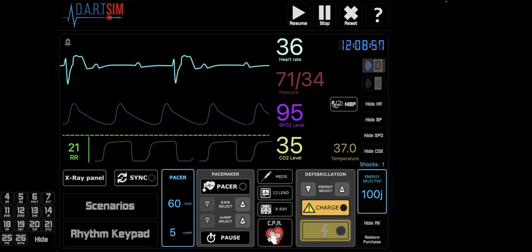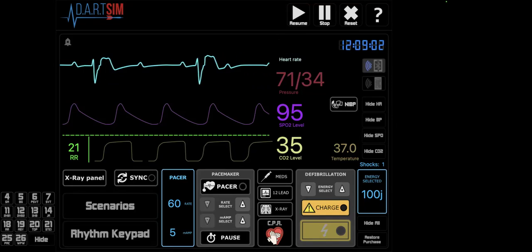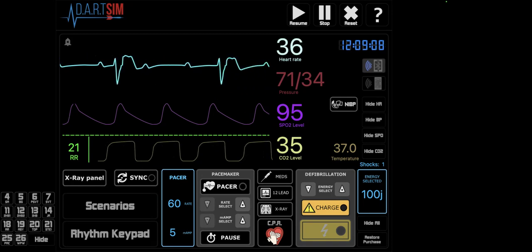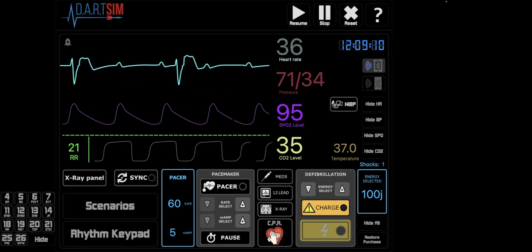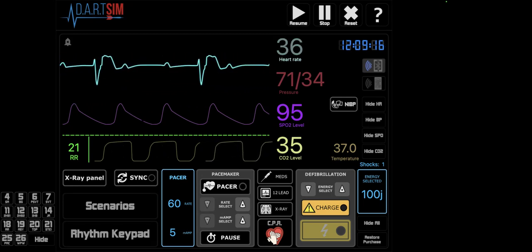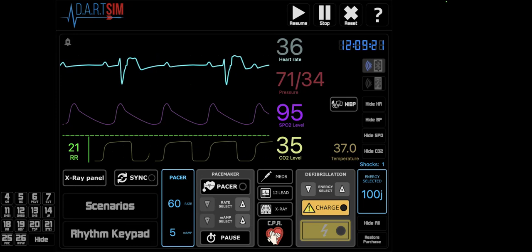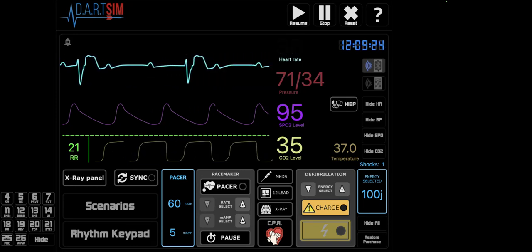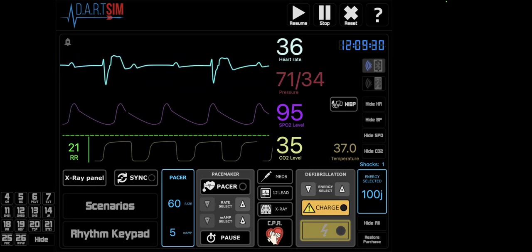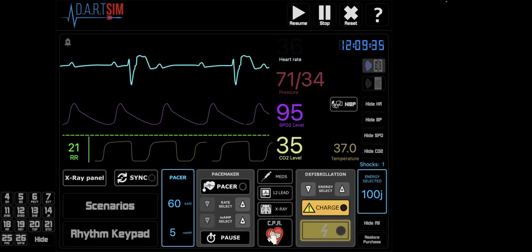And the combo means that you can defibrillate, cardiovert, and pace all with the same pad. You also need the ECG electrodes from the defibrillator attached to the patient, even though he has the bedside monitor electrodes attached. It's just like cardioversion. Whenever the machine needs to sense the patient's intrinsic rhythm, you need to have the ECG electrodes on the patient that are connected to the defibrillator.